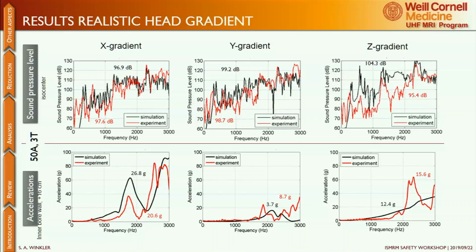But you also said with this ceramic bore liner or gradient liner, which you suggested, that you can get the total level down by a quite impressive amount. So how does that relate? Is this doing more than affecting the coupling between the structural and the acoustics, or what is the effect of the ceramic there? I think those are two different effects.